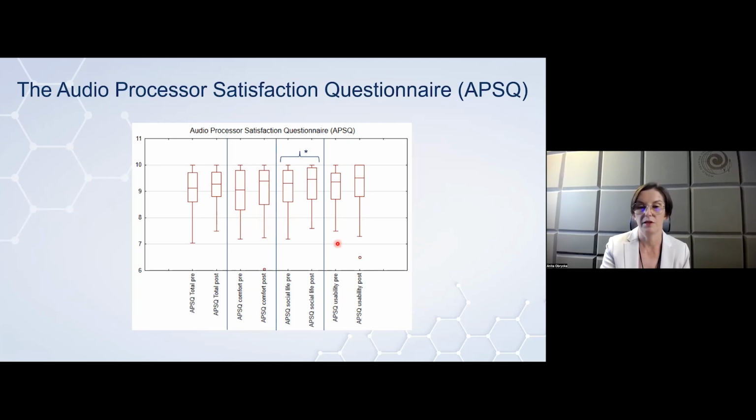So the comfort and usability are probably similar, but we noticed the improvement in the social life dimension, which is very encouraging. And of course, it could be due to the new feature of the sound processor, I mean this adaptive intelligence or directional microphone, or maybe this change could be due to the fact that all children are having a completely brand new speech processor, so the previous one could be somehow also not in a very good condition. So we are not exactly sure what the reason for that difference is. We hope so, of course, but overall, the new speech processor was beneficial for patients.